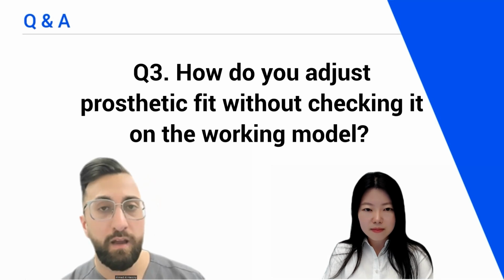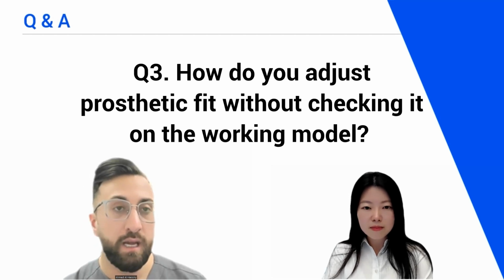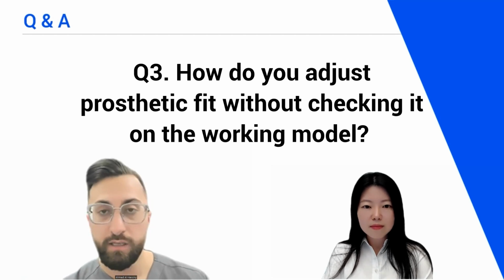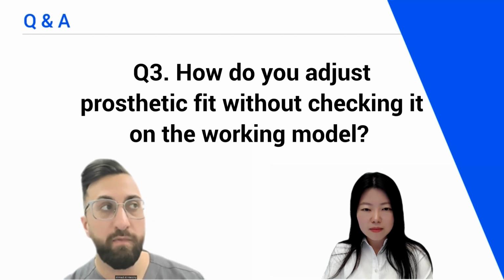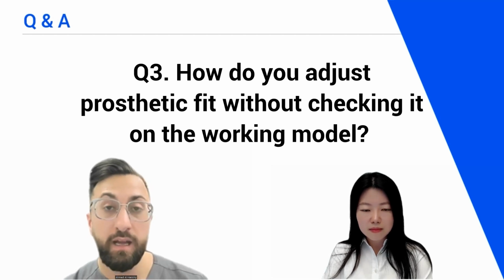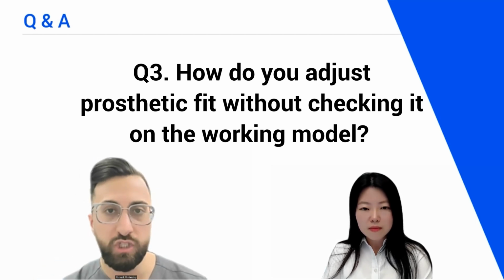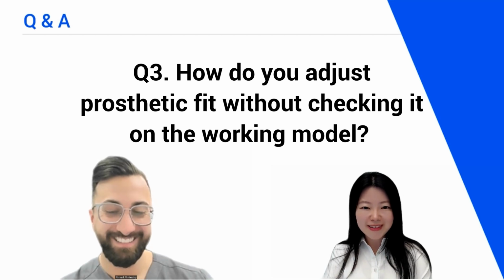And in particular, if you're trying to check fit, I do all my crowns modelless. I don't print a model for all my crowns. I will be checking it intraorally. So I would mill the crown, check it. By experience, you will just become very proficient in designing crowns that don't need adjustment. But if you do need a bit of adjustment, I just fit it in the mouth, check it, and adjust chairside. That means you prepped very well and you didn't assume any margin.